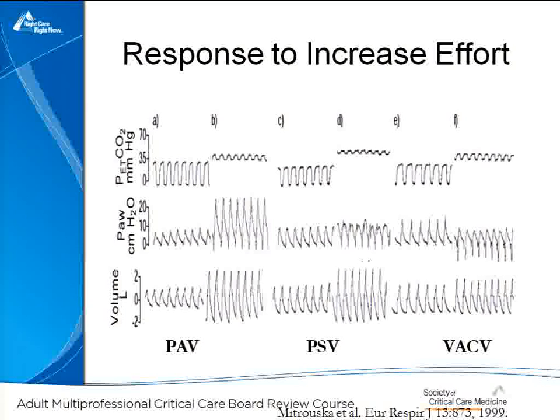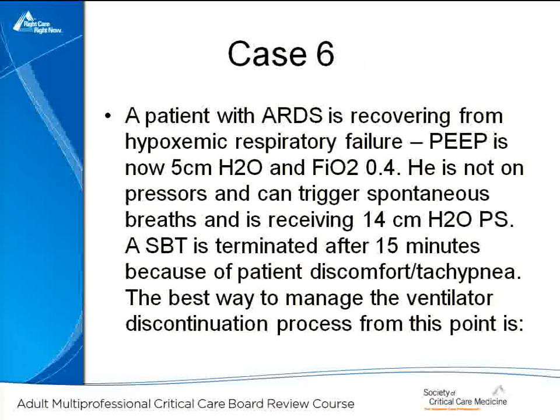Pressure support, you increase the drive. The volume does get bigger, but the pressure is maintained. That's what drives the increase in tidal volume. The bigger drive, the pressure is maintained with pressure support, and the tidal volume gets bigger. With proportional assist, notice you get increases in both pressure and in volume. So it's a little different form of interactive support. There are anecdotes that say it may help synchrony. It makes a lot of theoretical sense. The downside, as I say, there is nothing to guarantee support if the patient's effort diminishes.